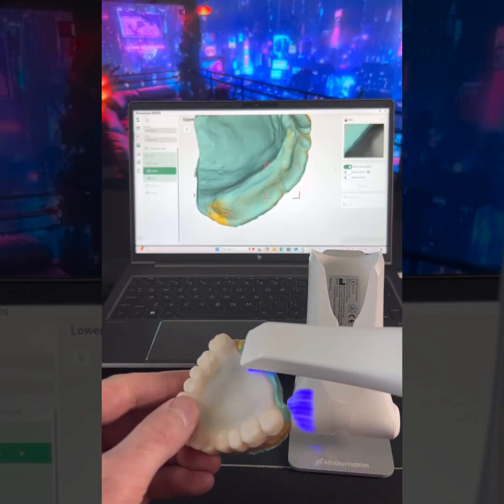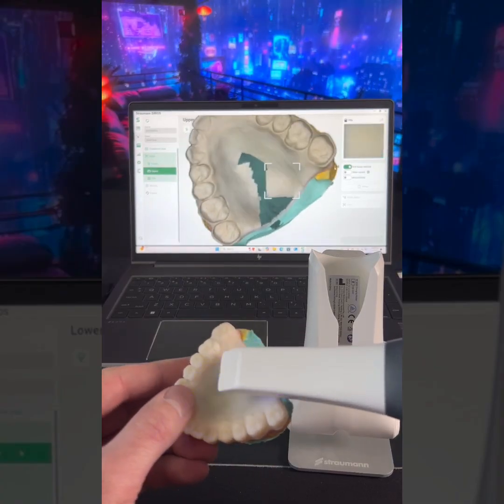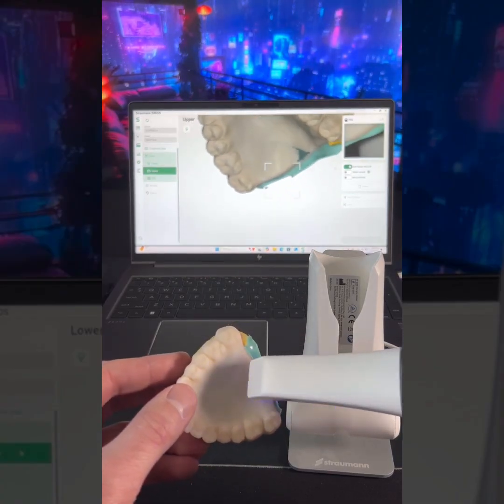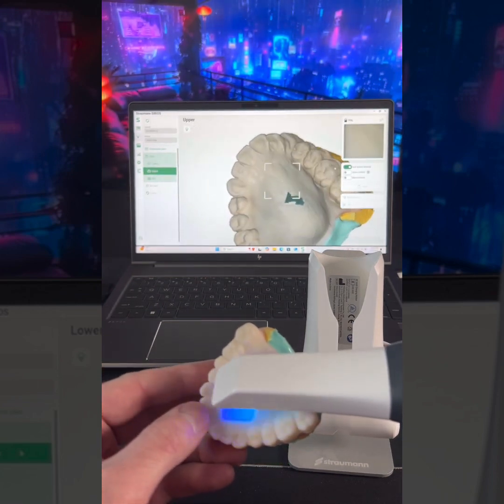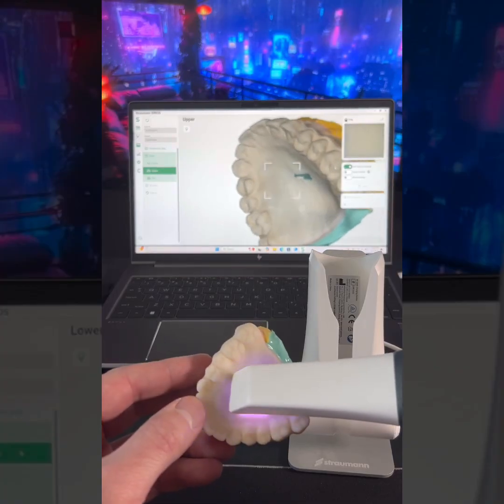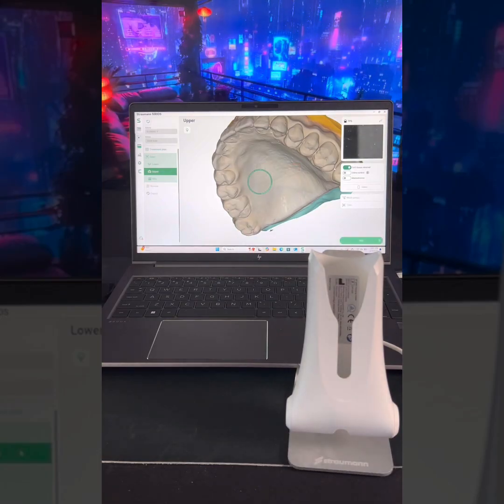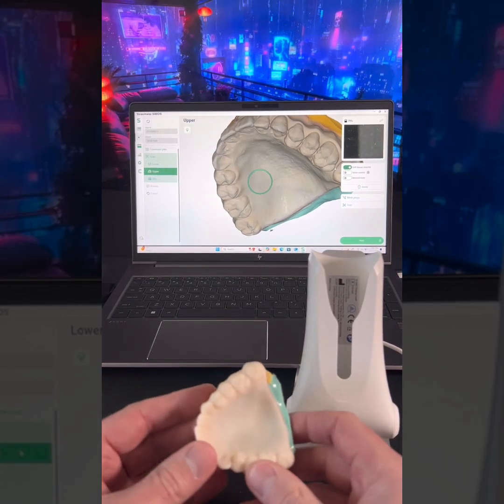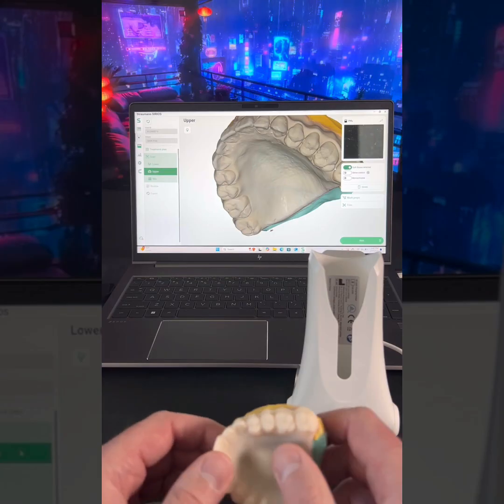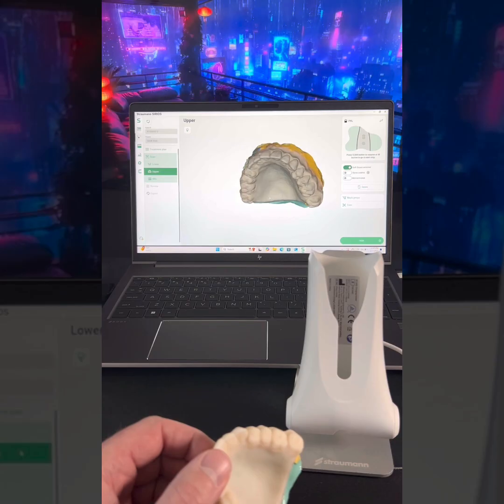I'm going to miss a spot up here. Let me fill this in. See how that turns out. Actually it's pretty smooth. I've got to tell you — this is a demo unit, so the mirror is slightly speckled, as you can see up there.